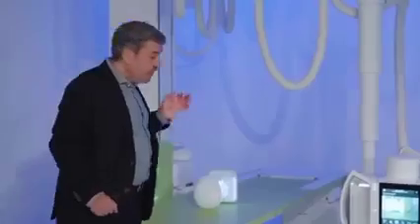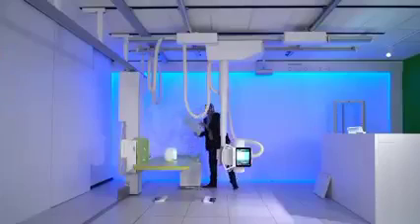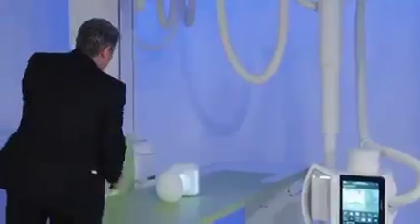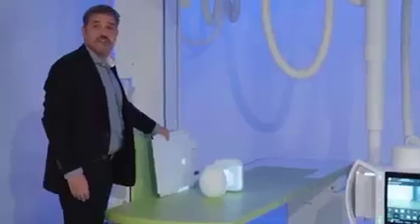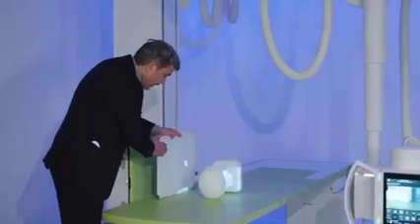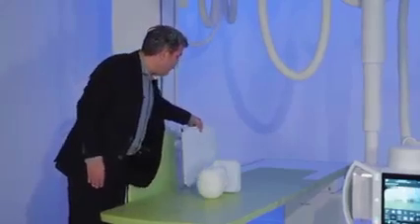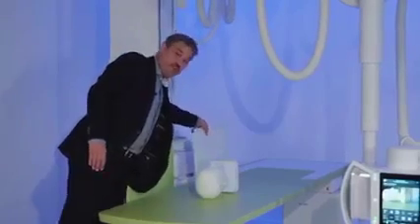This is what matters. The only way to do this, if you will not have such a movable wall stand, is to use a wireless detector. A wireless detector that anytime you have to put next to the patient, it's done with a manual exposure technique, and every position you have to move this detector accordingly.